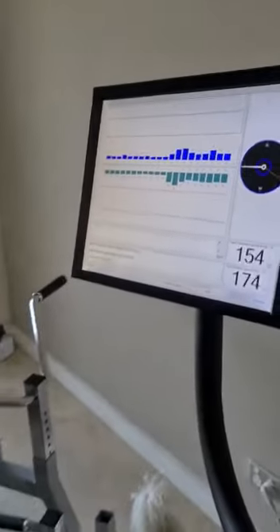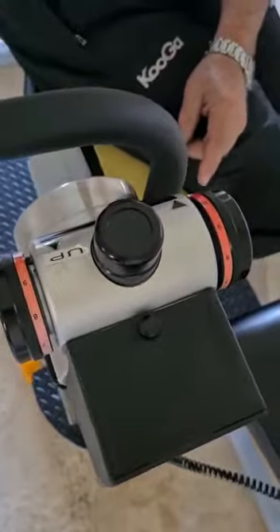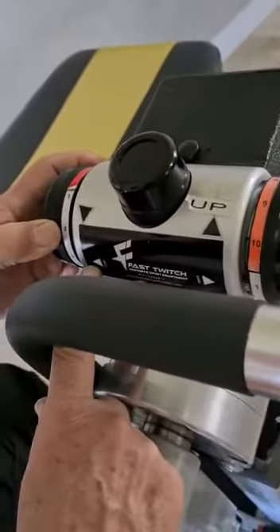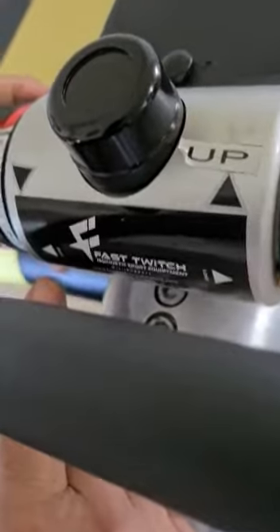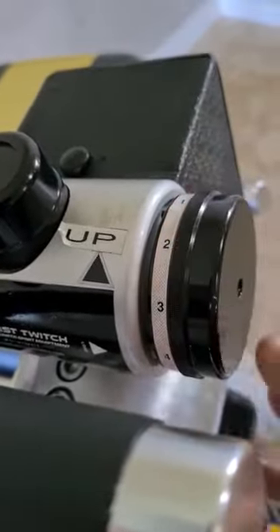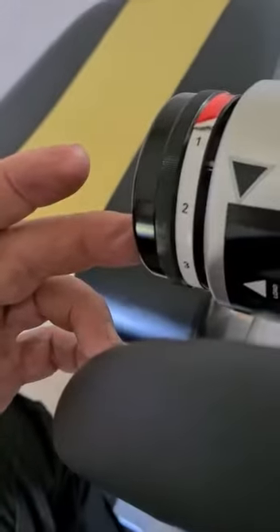And the dial settings are selected around on the control valve, where we have a flexion or extension, or up and down movement, and we have the ability to select from a 1 to 10 scale on each side, which determines the force and the speed.